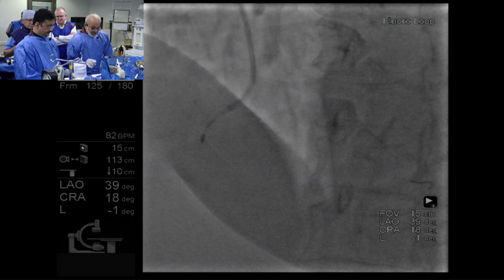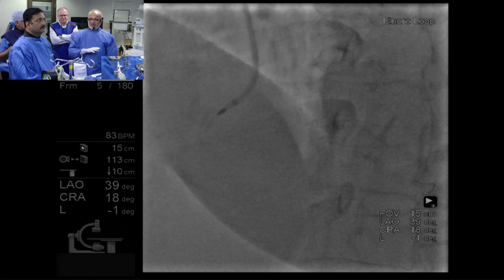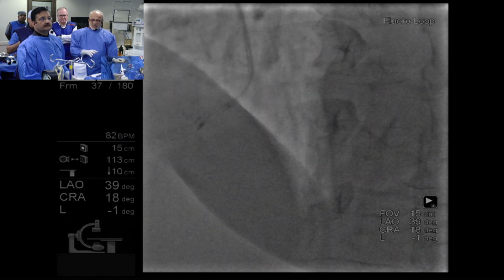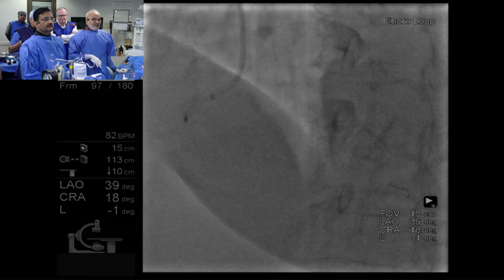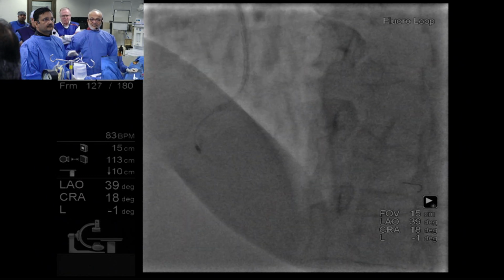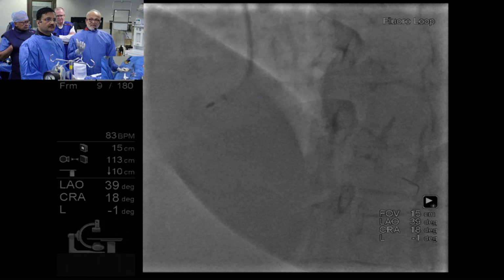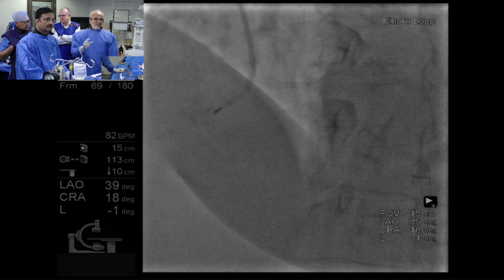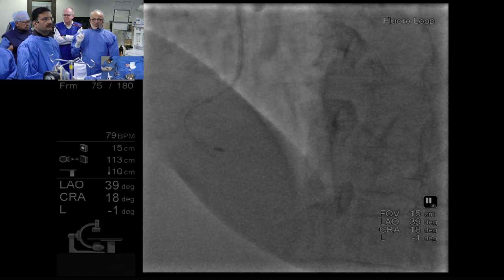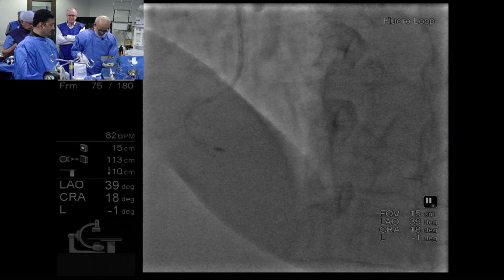He is holding it. So, Rajiv, for a solo operator will not do. There are experts who are doing it. But these young guys, I will always say, you are doing a complicated case. Even if you are not partners, you should have some sort of temporary partnerships for doing this type of complex case. Because 2 or 3 brains will always work better than one brain when some problem happens. I 100% agree with that, Tejas.